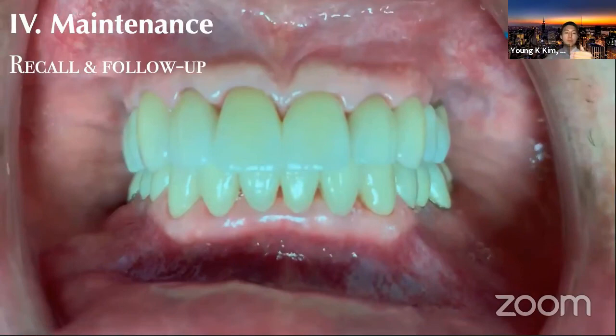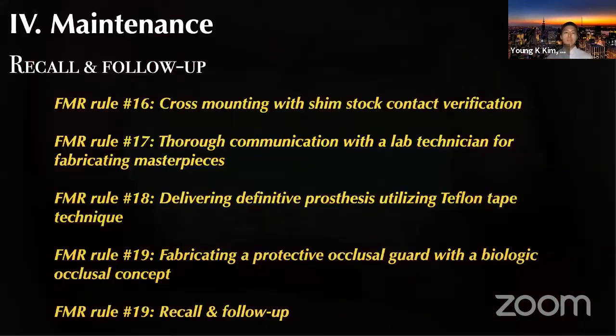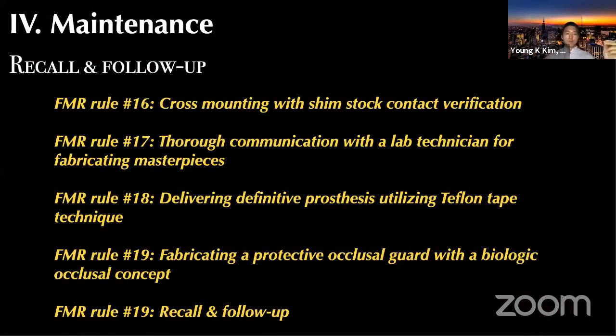You design your recall and maintenance. You check the occlusal guard, see if the patient is wearing it, and check occlusion with shim stock, margins, and hygiene as well. So, rule number 16, cross-mounting with the shim stock verification, is absolutely critical. Number 17 would be thorough communication with the lab technician for fabricating your prostheses.